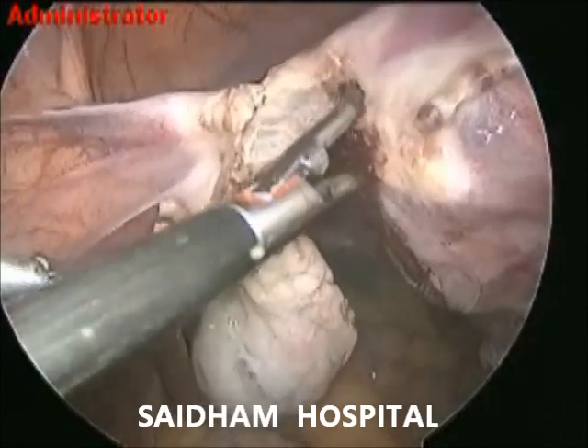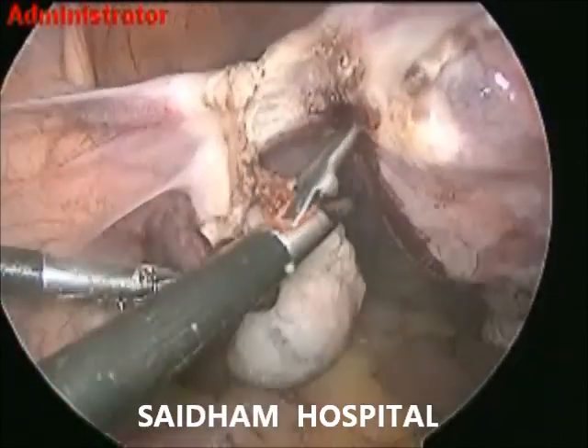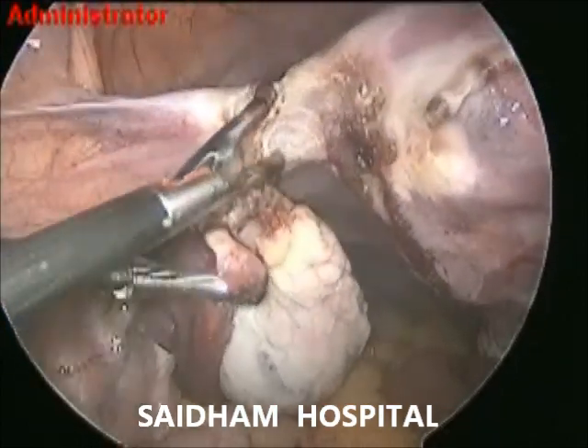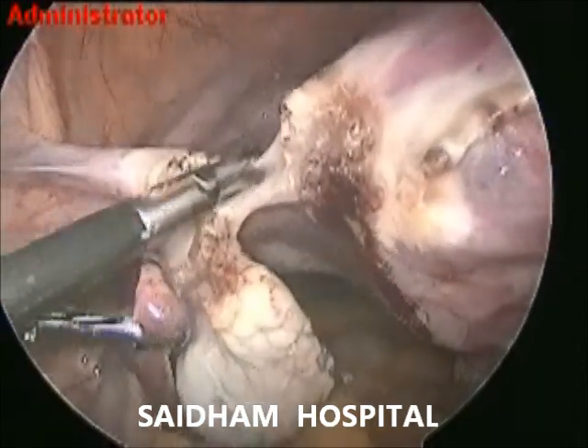This is ligation mode. If you hold loosely, it can coagulate. If you hold tightly in small bites, it will cut. We can see a very vascular uterus with endometriotic implant. I think this is stage 2 to stage 3 endometriosis.